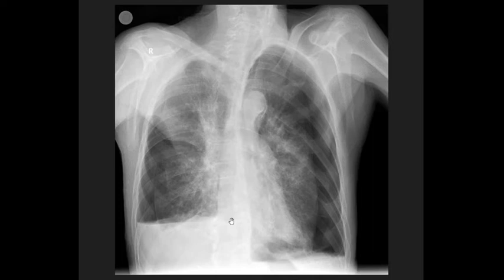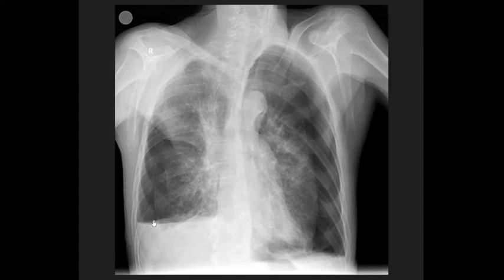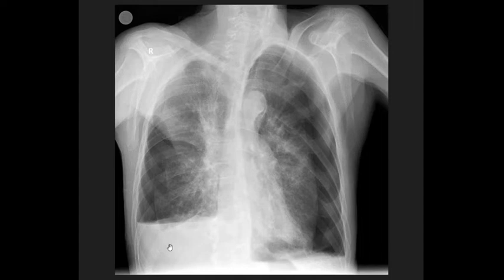This next case is very interesting — both lung fields look problematic. On one side we see the line of the visceral pleura indicating a pneumothorax, and on the other side there is also a pneumothorax line. Additionally, there is a horizontal line and a soft tissue shadow with fluid — this represents a pleural effusion or hydrothorax. The combination of air and fluid in the pleural space is called hydropneumothorax.